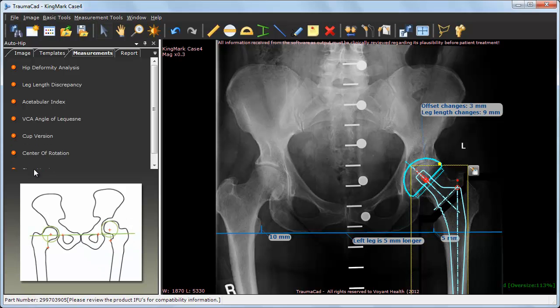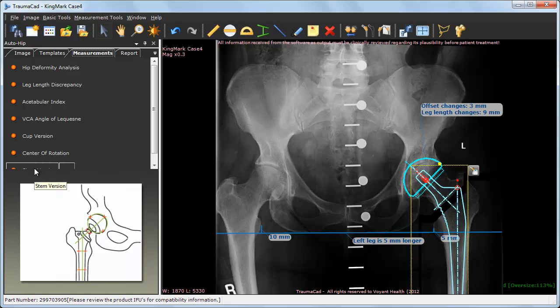Remember, the tools and implants library are filtered according to the currently selected procedure.